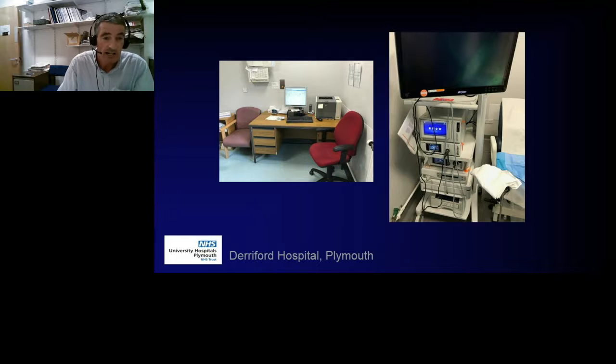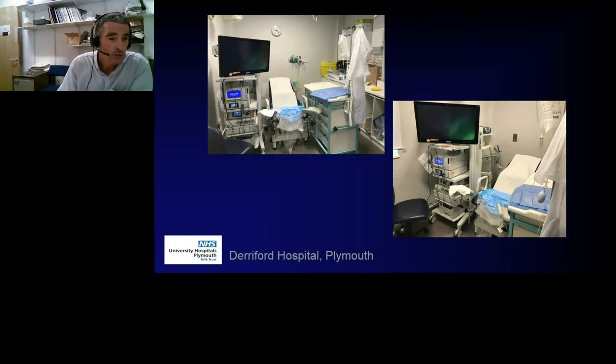This is a picture of the stack, so you don't need a huge amount of equipment, but a monitor, something to be able to take photos, the camera, and a light source, and a printer is often very helpful for printing out the photos. This is a photo or two photos of the area. So for those who don't have a huge area or a huge room, it just shows that you can perform it in a relatively small area.